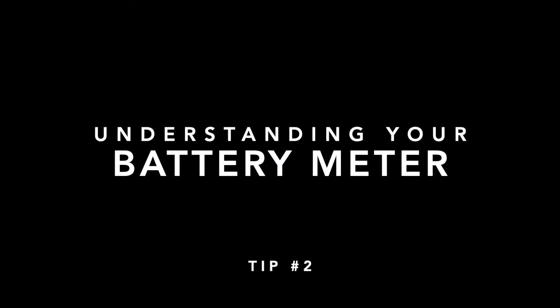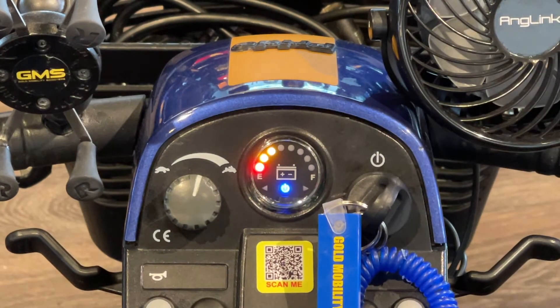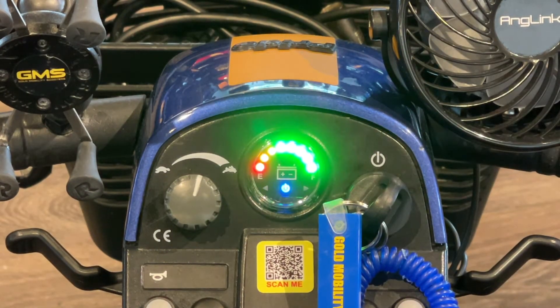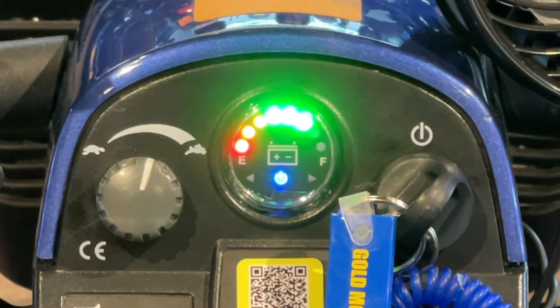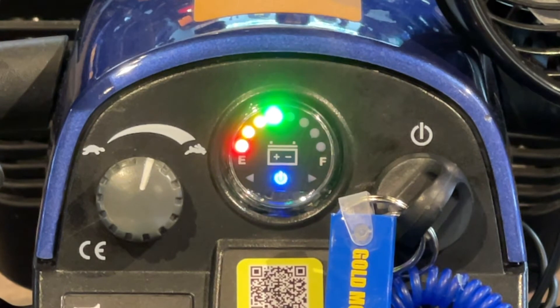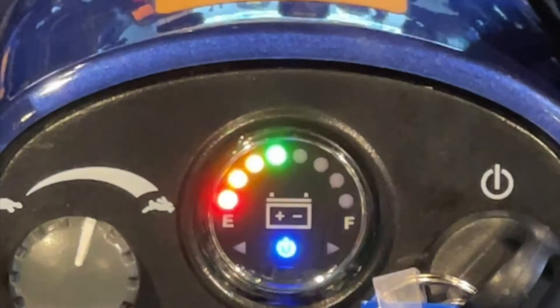Understanding your Battery Meter: this is fully charged — the more green, the better. Like a car gas gauge, the meter lights move from right to left the more it's used. Note that the lights may bounce around a little. This is normal.